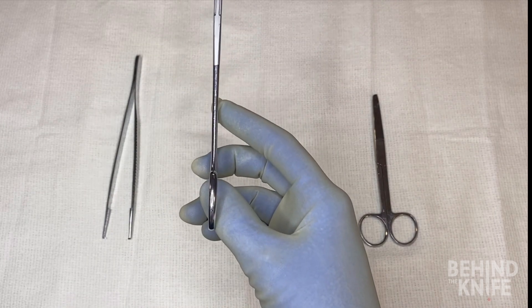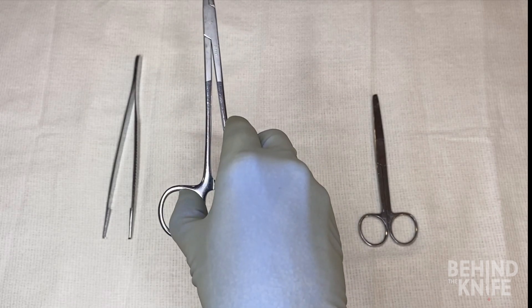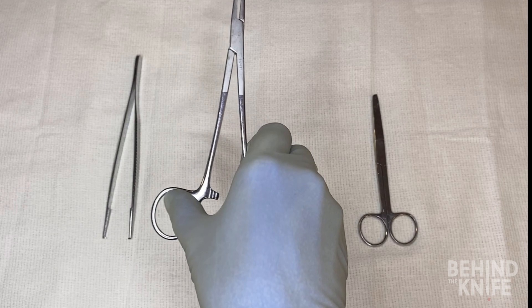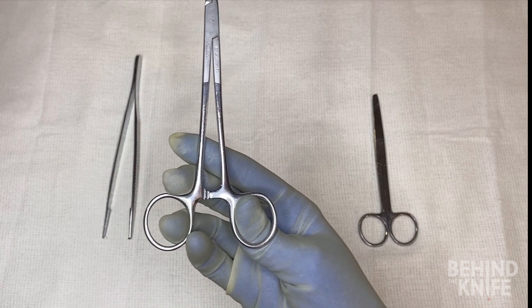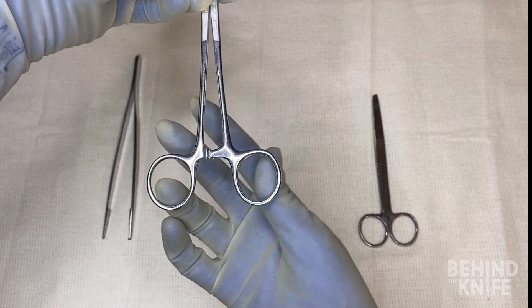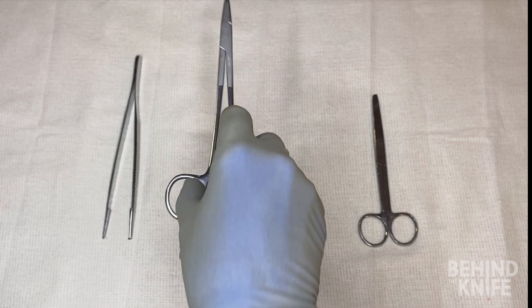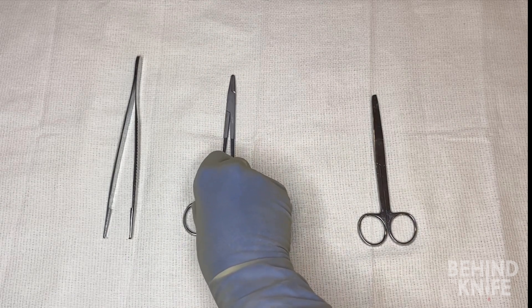For locking instruments, you'll want to push out with your thumb to unlock the instrument. You may see attendings or residents palm the instrument, but it's often best to utilize that technique once you have a good foundation of your surgical skills and feel comfortable holding the needle drivers with your fingers first.